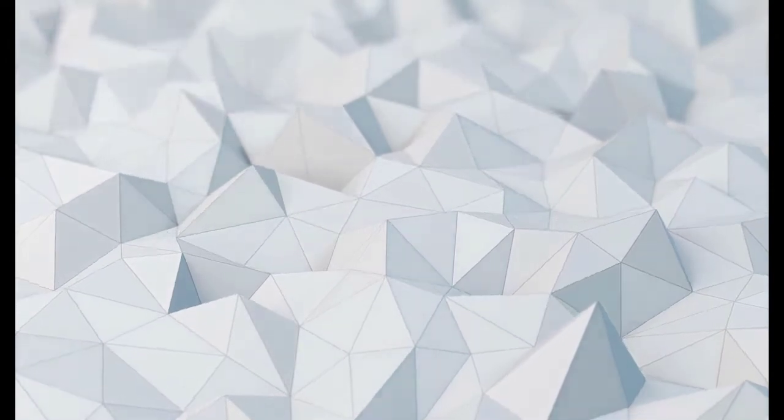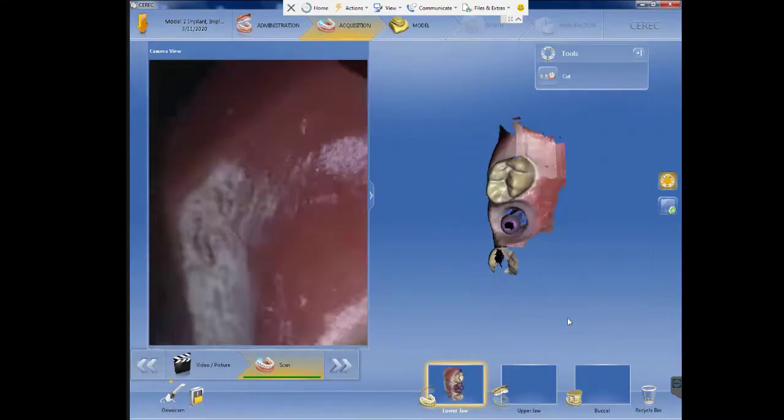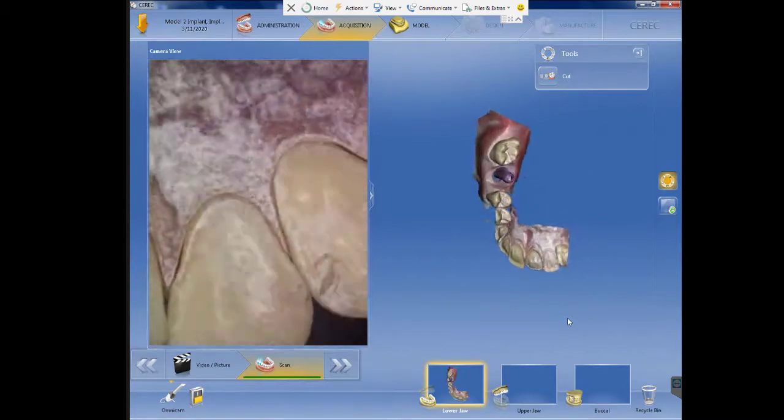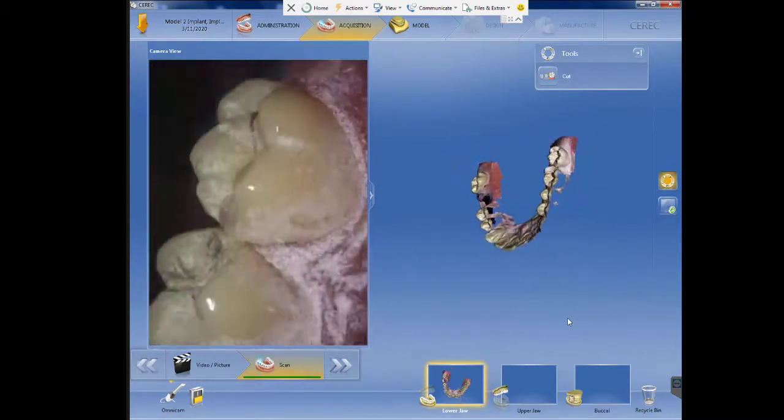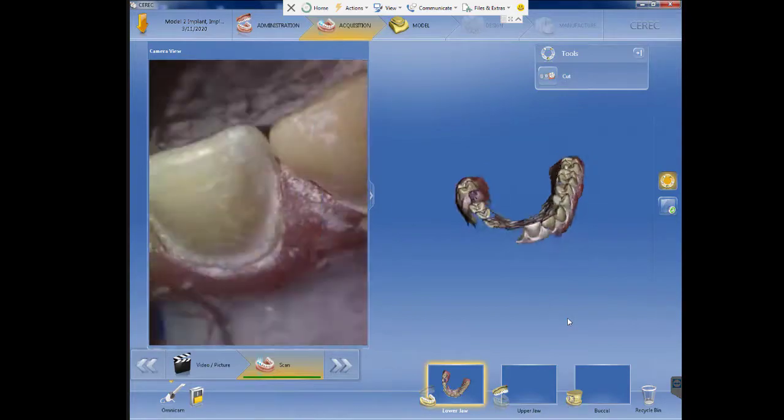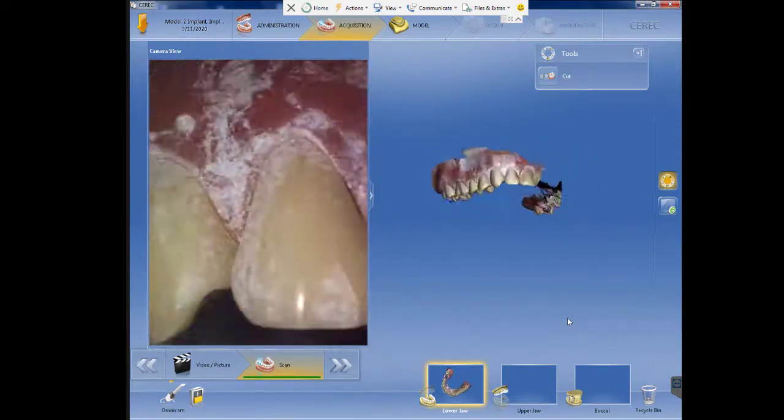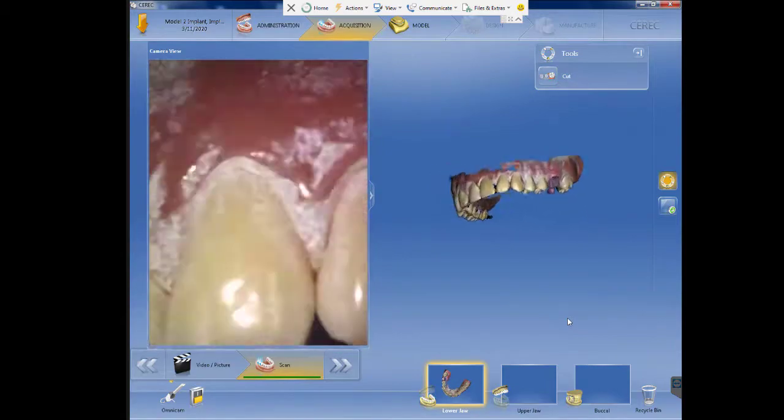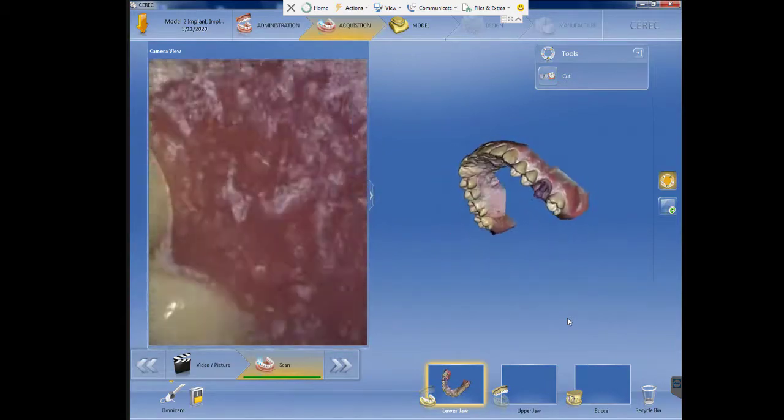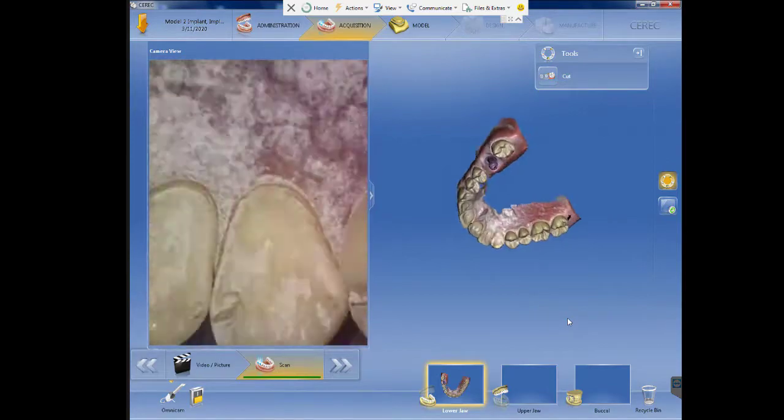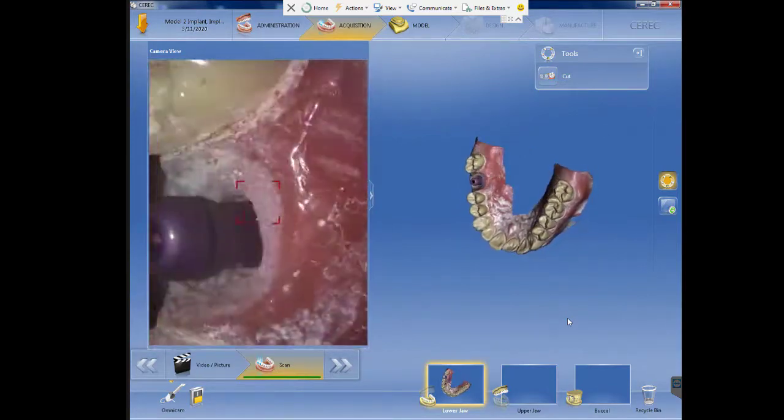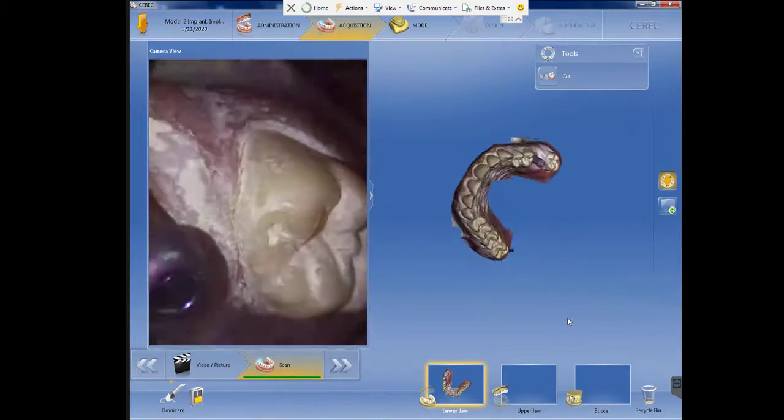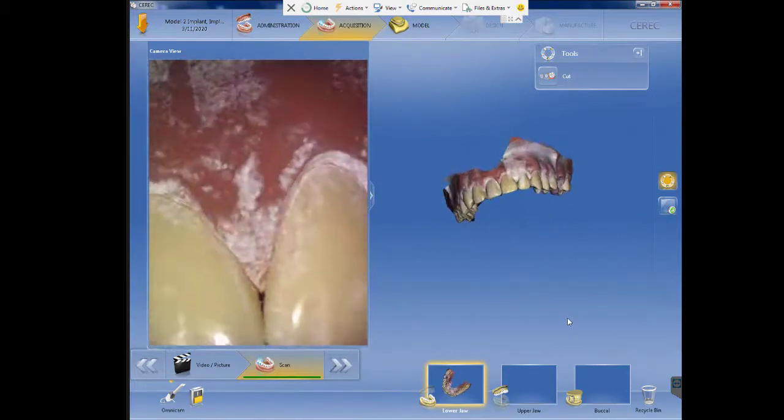Basically we will start with an anchor, an occlusal, then we will go to lingual or palatal and incisal, and after that we will go towards all the buccal surfaces. We'll scan all the palatal surfaces and then you'll scan all the interproximal surfaces and the soft tissue surfaces.